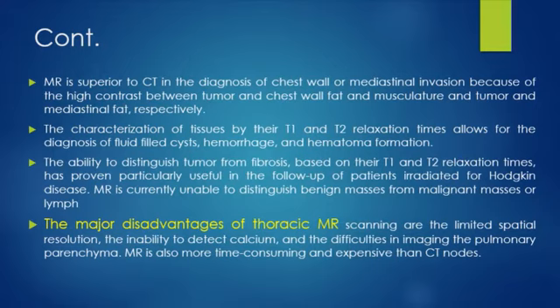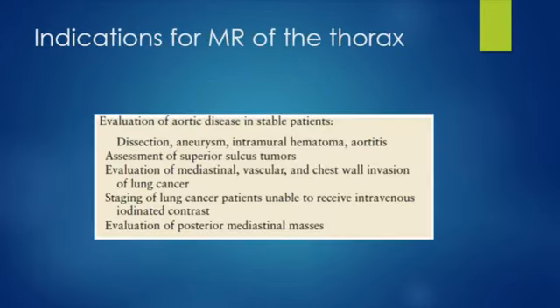The major disadvantage is that MR is currently unable to distinguish benign masses from malignant masses or lymph nodes, and it has limited spatial resolution, the inability to detect calcium, and difficulty in imaging the pulmonary parenchyma. MR is also more time-consuming and expensive than CT.